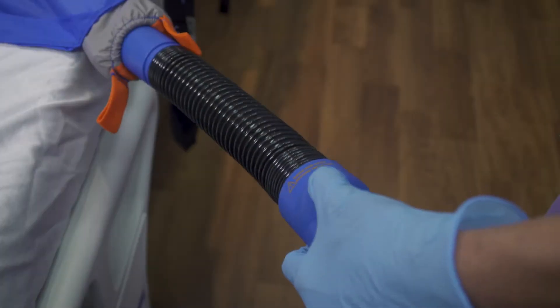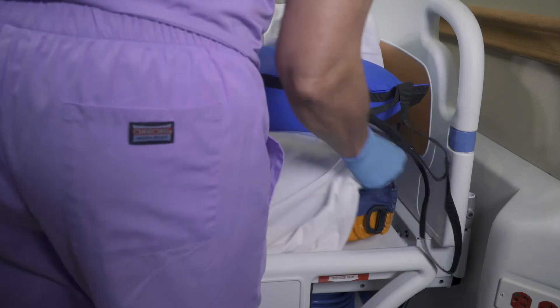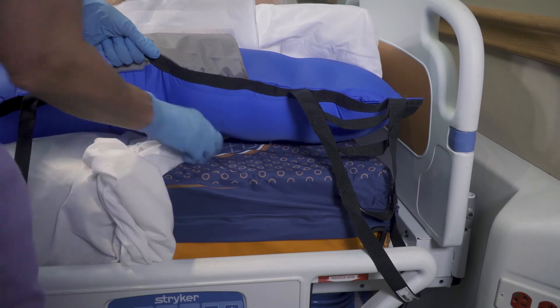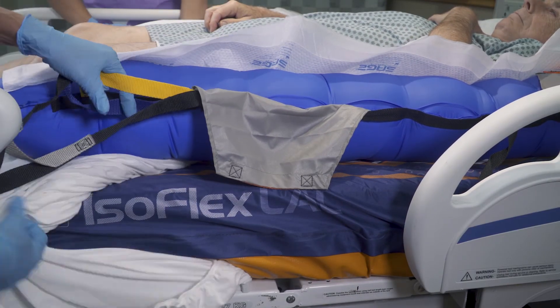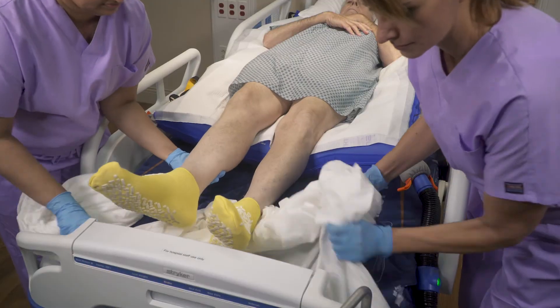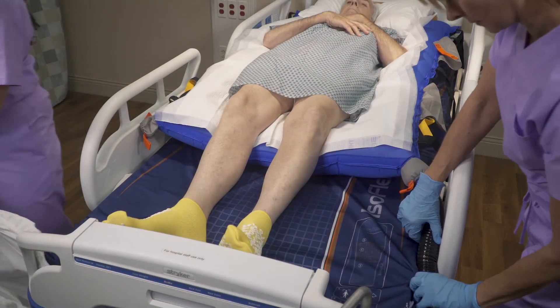To remove linens, turn on the air pump. Starting at the head of the bed, lift the corners of the linen and gently pull toward the foot of the bed while holding the glide sheet in place. Remove the linen and turn off the air pump.